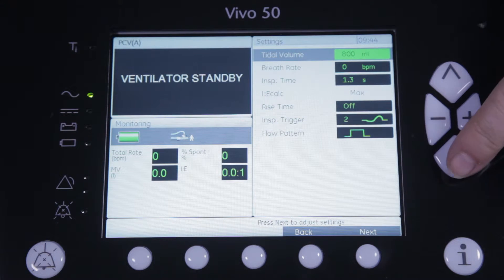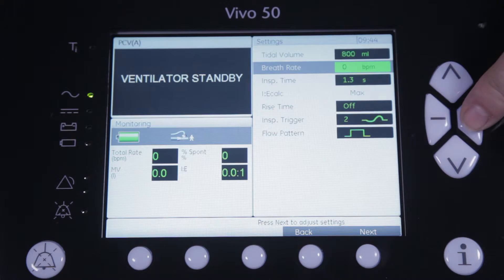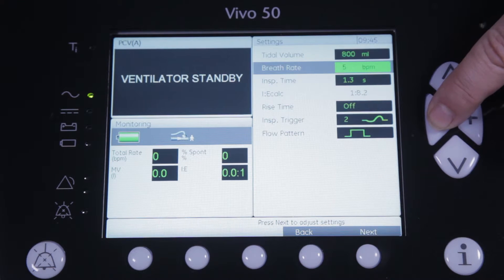Next you can either choose to leave the breath rate at zero so that the patient will trigger every breath as desired, or set a certain mandatory breath rate. In our case we will leave the rate at zero and let the patient decide when to take a breath.